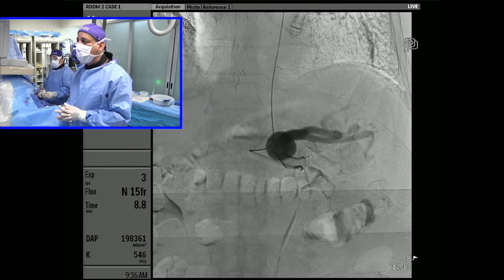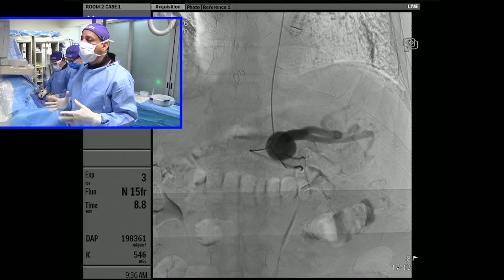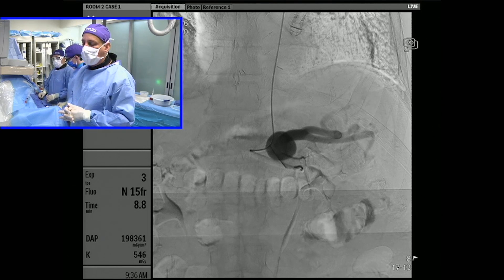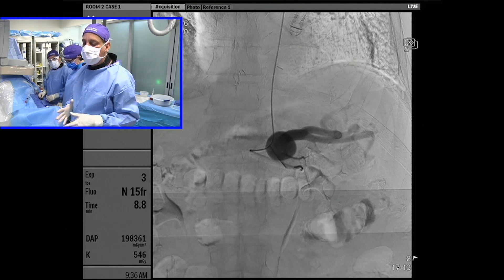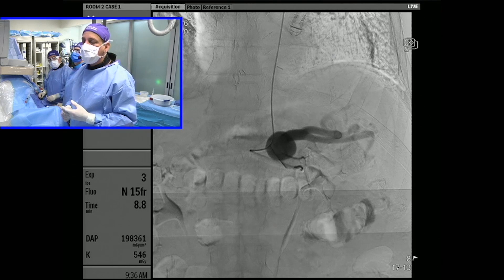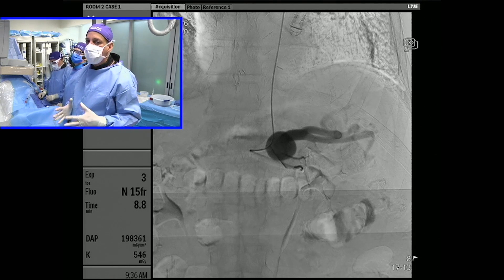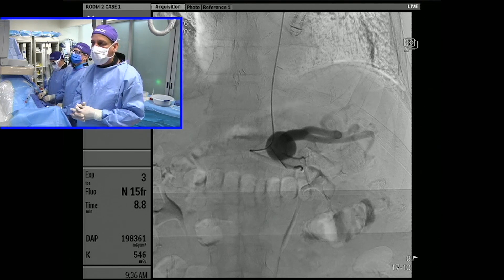The aneurysm diameter is about 26 by 30 millimeters. The diameter of the splenic artery is 10 to 11 millimeters based on where you're measuring it.